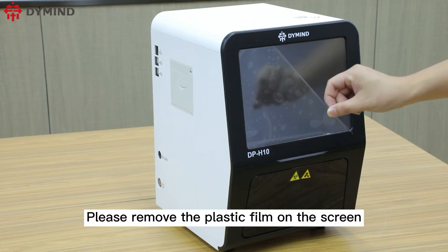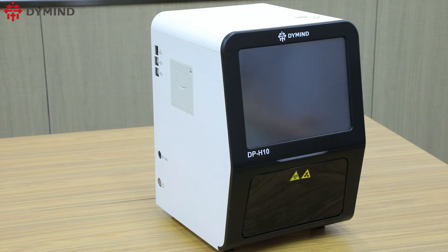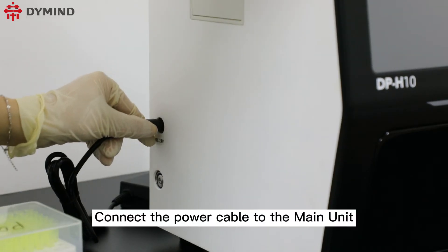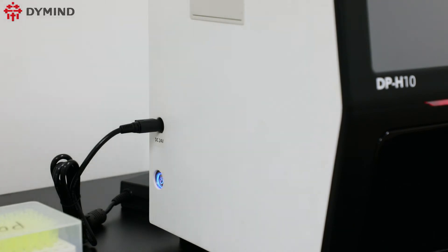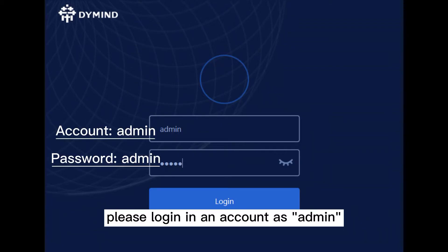Please remove the plastic film on the screen. Connect the power cable to the main unit and then press the power switch to enter the login interface. Please login with an account as admin.